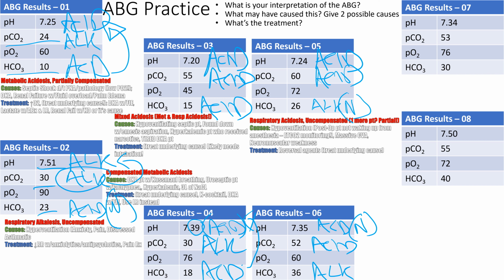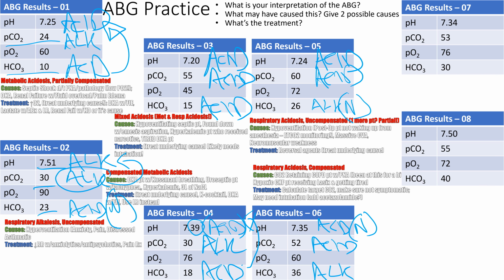Asthma, it'd have to be like an obstruction, like they're having no CO2 leaving their body. Right, severe asthma. This also could be just a COPD patient. COPD patients, emphysema patients, they live at a high CO2 level all the time. Okay, so what's the next one?